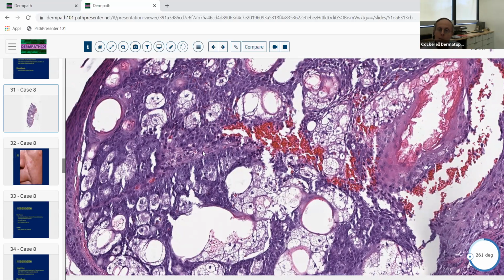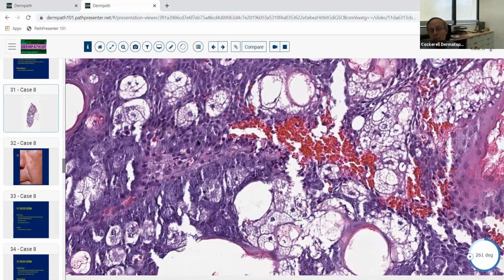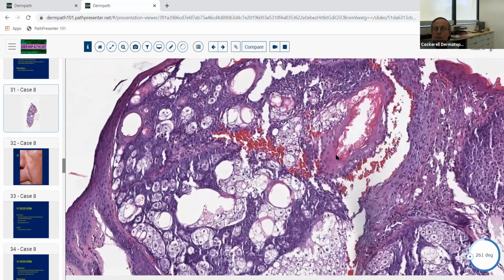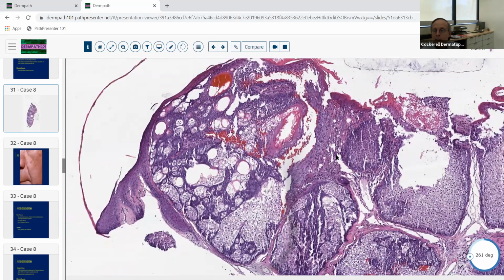So there are all these little basophilic stem cells that Dr. Lay was talking about a few weeks ago in his lecture. So they're forming mature sebaceous cells. Sometimes you get neoplasms that are comprised almost wholly of those cells. So a sebaceous lesion can either be mostly mature cells, greater than 50%, or greater than 50% of the immature cells. And so when we see greater than 50% of the mature cells, and it's forming a little cup-shaped lesion like that, what's the diagnosis in that case?